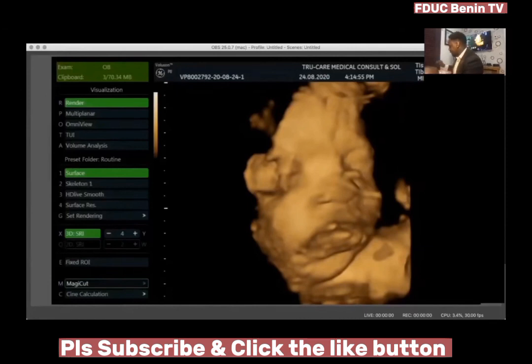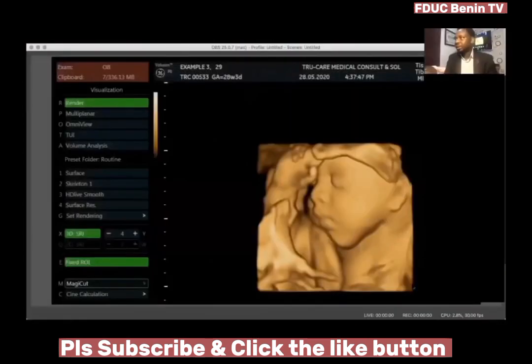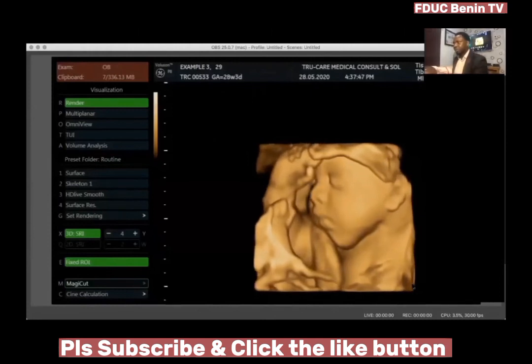Hello, ma. I want you to just tilt a little to the side so that you're resting. Now, this is an image that was acquired some days back. And with this image, you can see that I tried as much as possible to get some features of the face. Sometimes it's a little difficult.